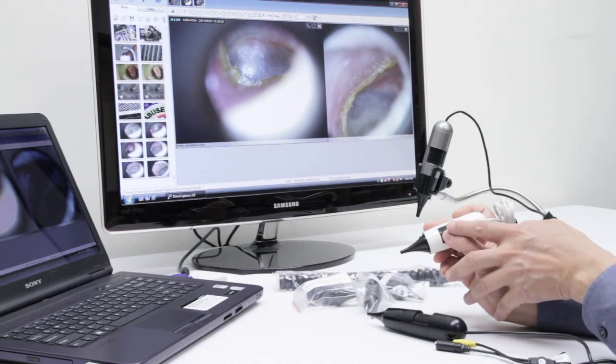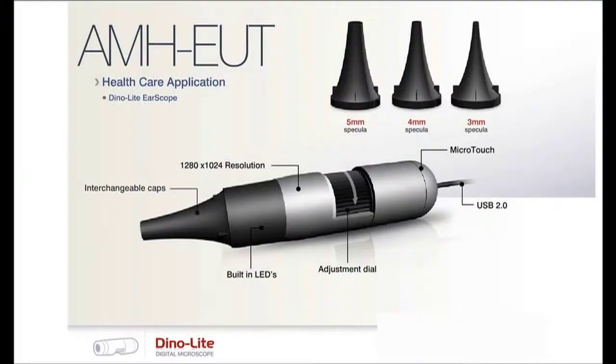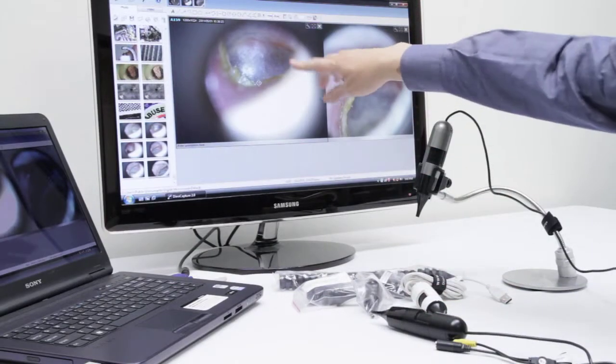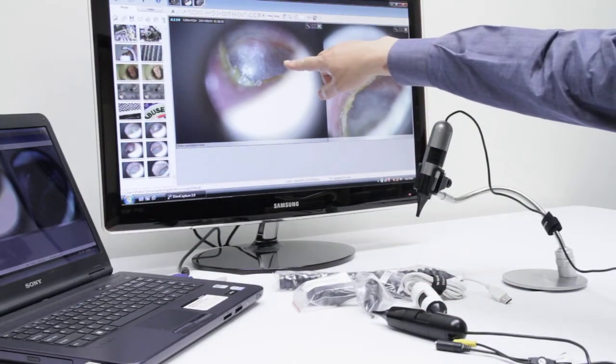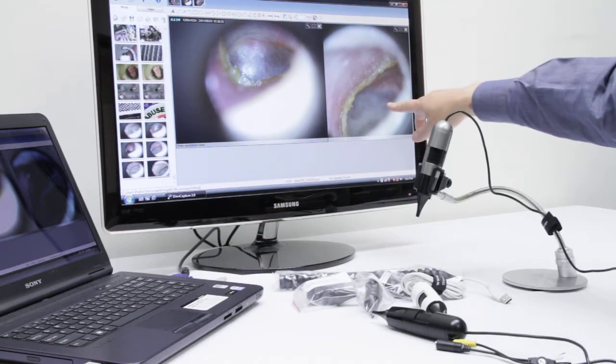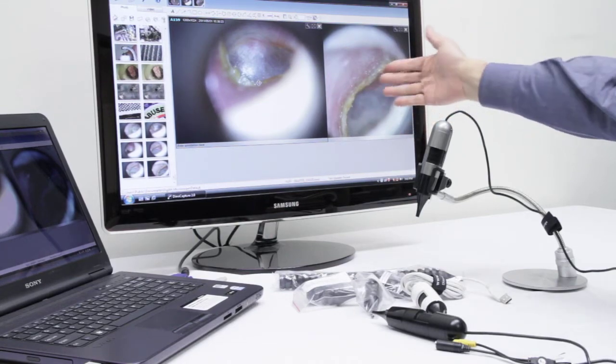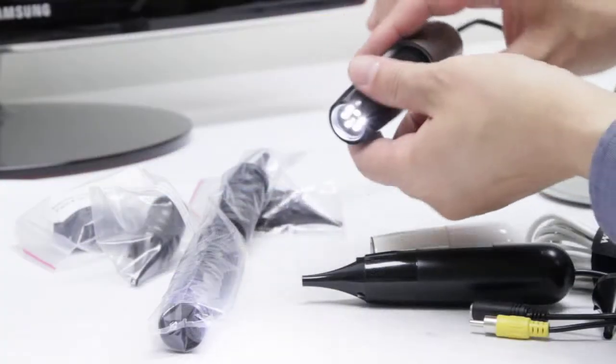This microscope that we're showing here has an optical zoom of up to 200 times the magnification. The setup of our Dino Capture 2.0 environment will allow you to compare and contrast pictures very easily.